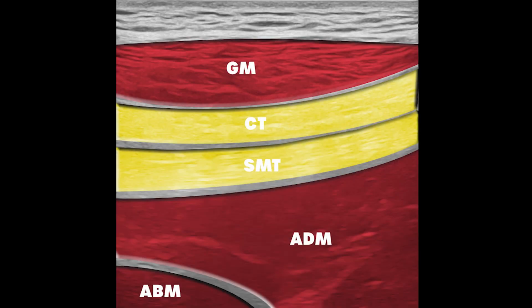The conjoint tendon of long head of biceps and semitendinosus lies on top of the semimembranosus tendon. By moving the ultrasound probe, we can examine the myotendinous junction and check whether the tendons are intact. Dynamic maneuvers with flexion in the knee joint are also possible.